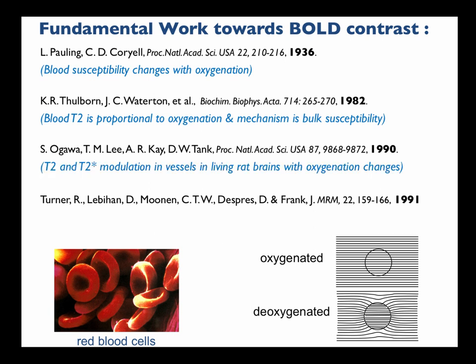Ogawa came along. He was working at Bell Labs at the time, and he actually coined the term BOLD, and he noticed T2 and T2 star, and T2 star was a lot more, and we'll get into later lectures the difference between these two. T2 star is actually much more sensitive to magnetic field inhomogeneities. T2 is sensitive to more microscopic inhomogeneities at the level of the capillary.